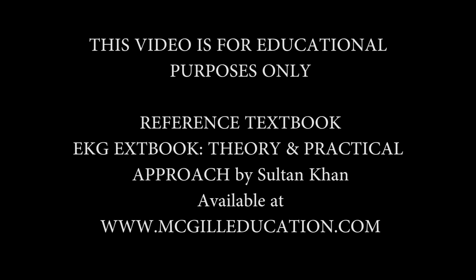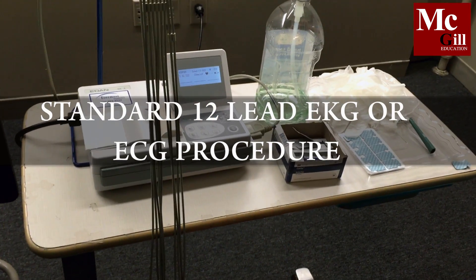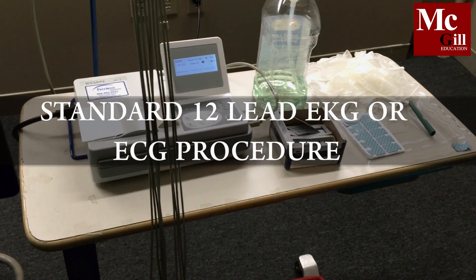We are performing a 12-lead EKG procedure. This video is for educational purposes only.